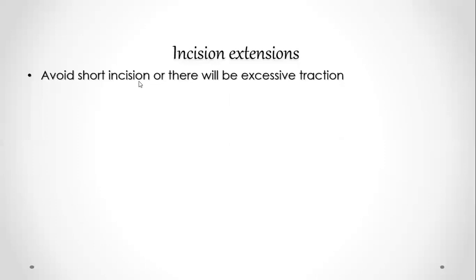If you do a short midline incision, you put in a jig or retractors, and sometimes you have to do excessive traction, and this is forbidden during surgery.